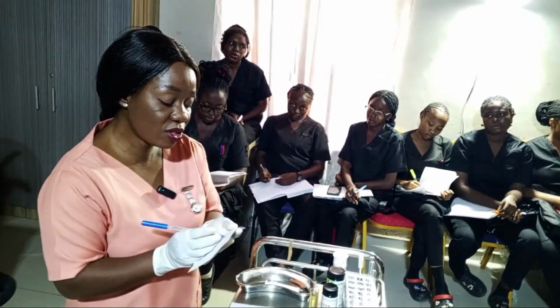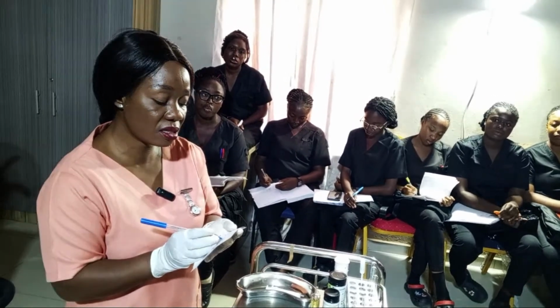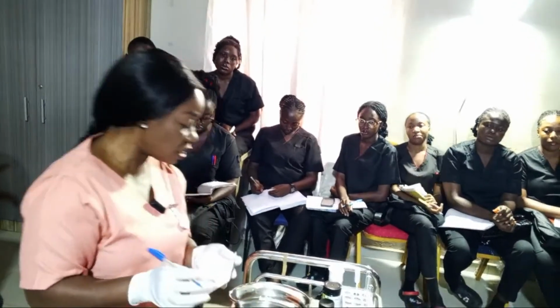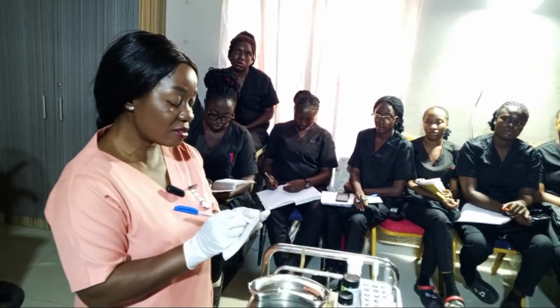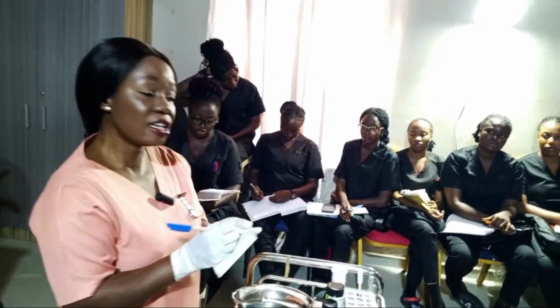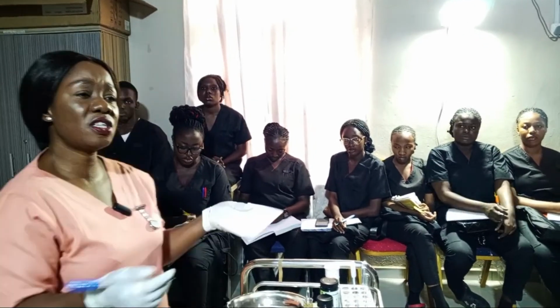And then we say the amount is what? 200 mls, right? And pH is what? We've taken the pH, and then the odour is automatic, and we have deposit. Of course, deposit present. Is it blood? Is it pus? Isn't it? And we are done with this urine testing.